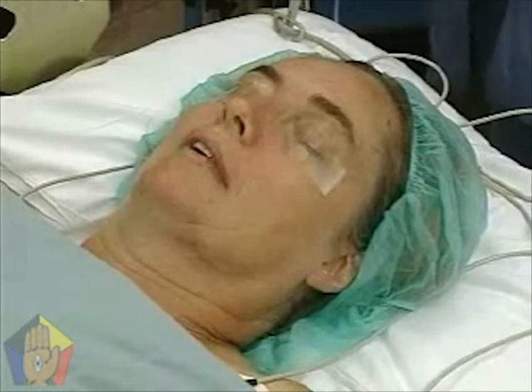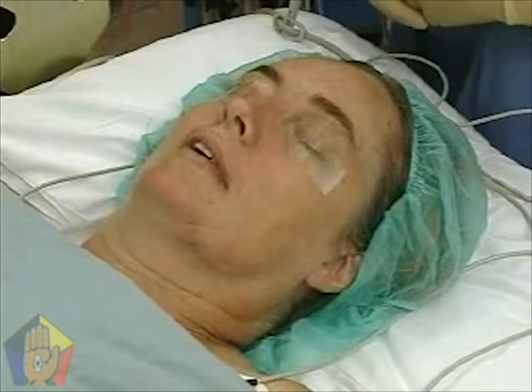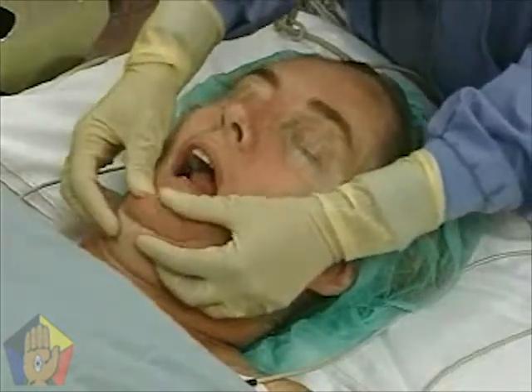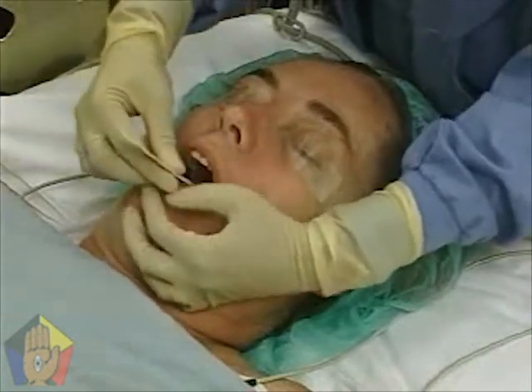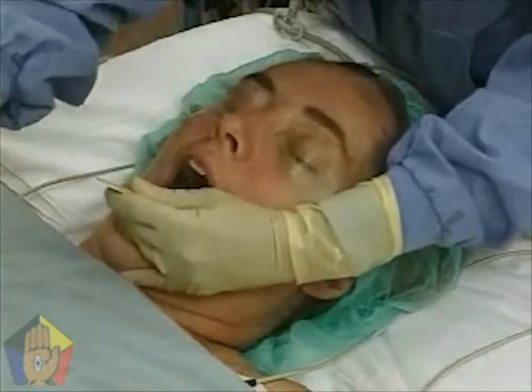Patient positioning should be supine or lateral. Open the patient's mouth. Place the tongue blade at the base of the tongue and draw the tongue anteriorly to lift it off the pharynx.